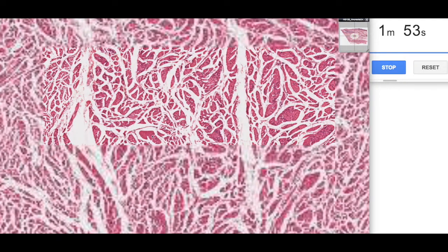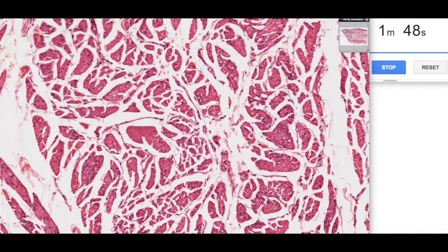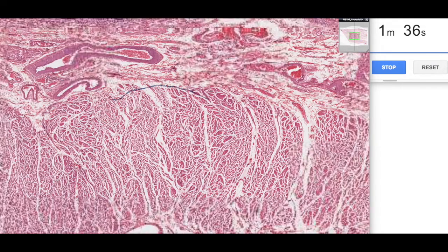If we zoom in, we can actually see that this is smooth muscle. It looks a little bit like skeletal muscle from the lower mag, but we can see very typical centrally located nuclei, which is typical of smooth muscle. So this is the internal anal sphincter, which obviously we don't have conscious control over, but helps to regulate defecation most of the time.